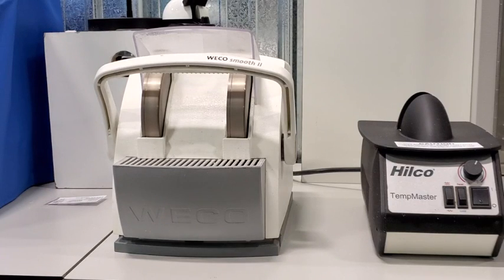It's ready to be used to give us a nice clean polish whenever we go to do that.